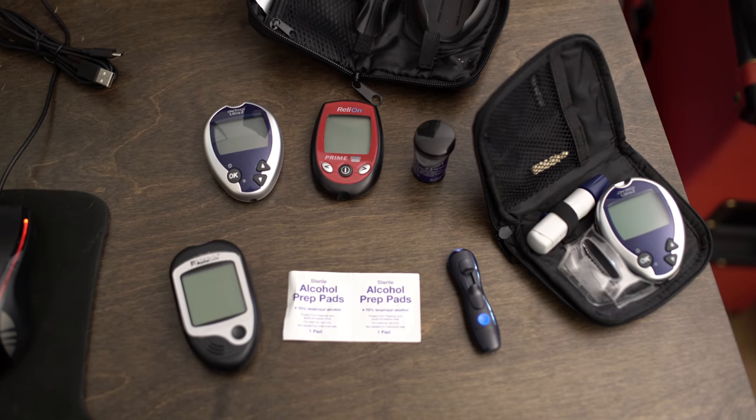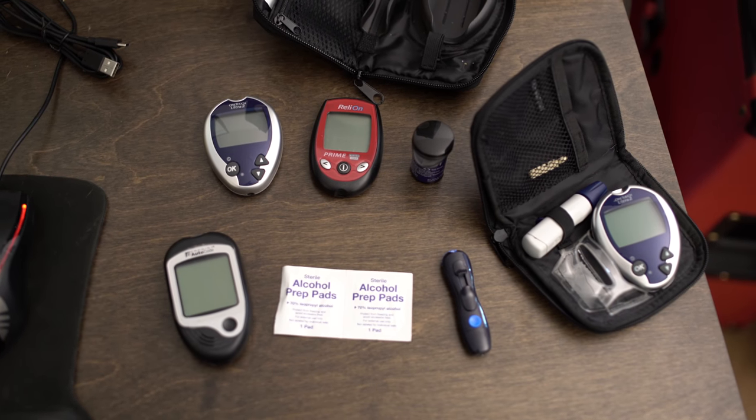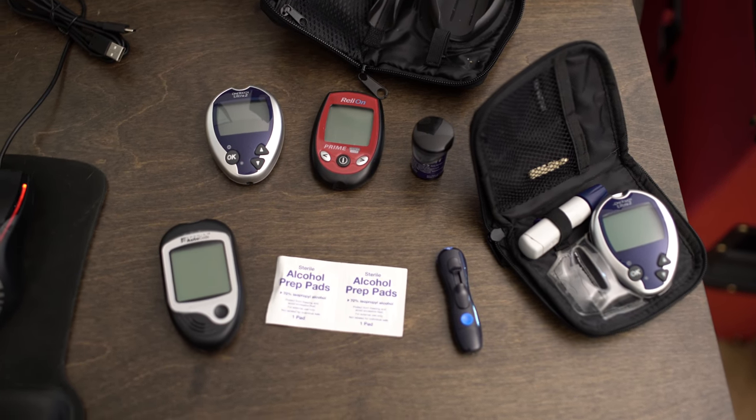Then there's the test strip. You got to pull the test strip out and put it in your machine. I've tried all kinds of different machines — I have a bunch of different ones. They're all pretty much the same, but getting your blood on the strip and getting it into the machine to work can sometimes be a hassle. A lot of times it'll just give you an error, which means you just poked your finger, got your blood, stuck it in the machine, and it gives you an error, so you've got to start all over again.